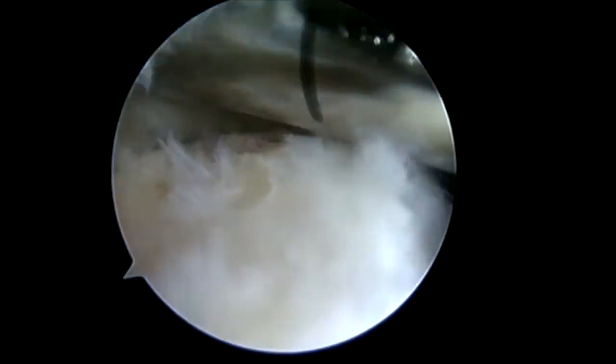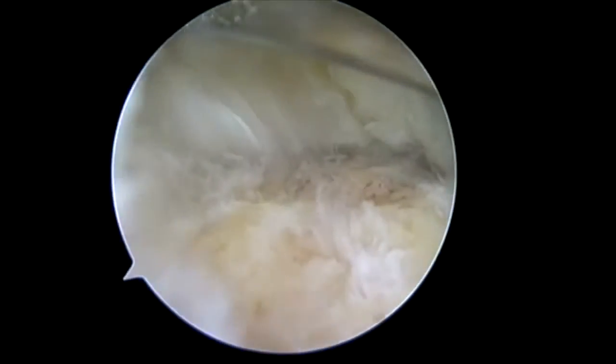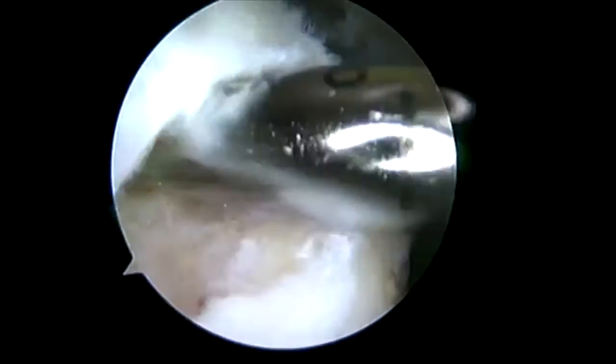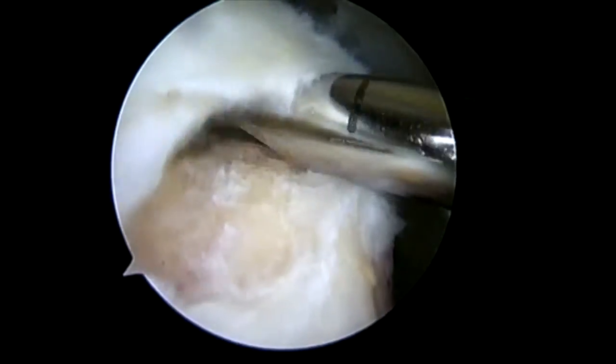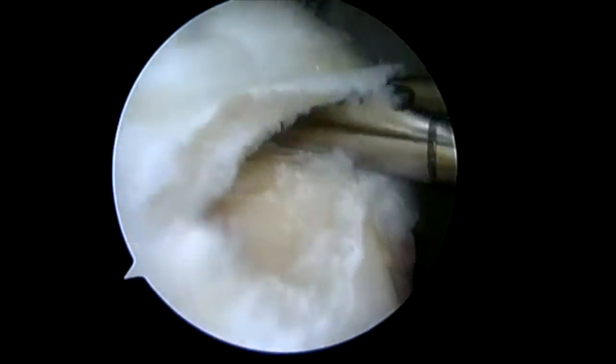With the rotation patch, it's a bioinductive implant. It's designed to be laid right on top of the rotator cuff. It will resorb in around six months, and the patient will grow new tendon-like tissue. So in this patient with a very thin rotator cuff, she will grow a more normal thickness rotator cuff following her repair.